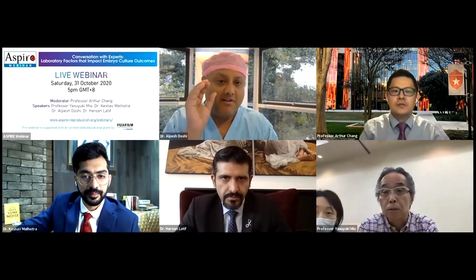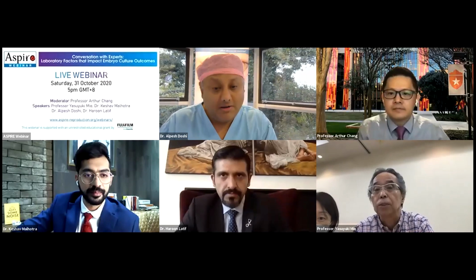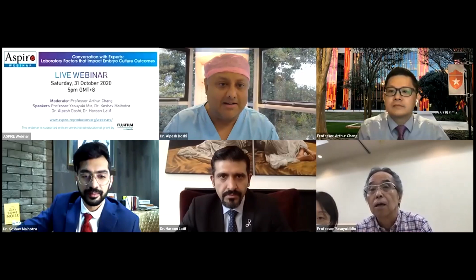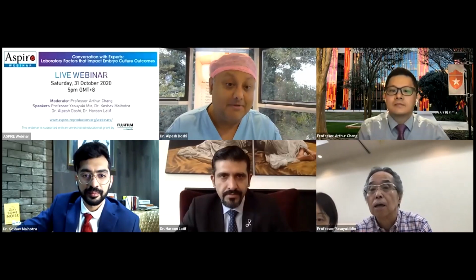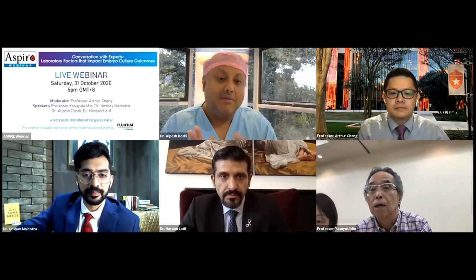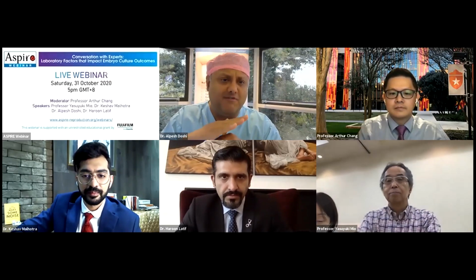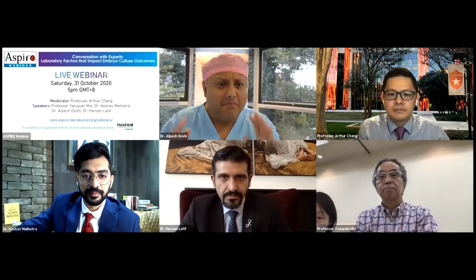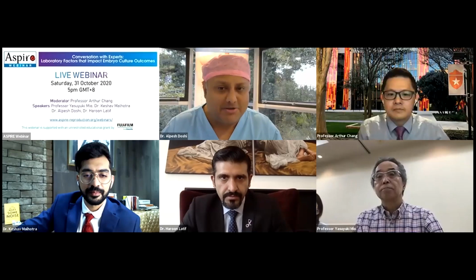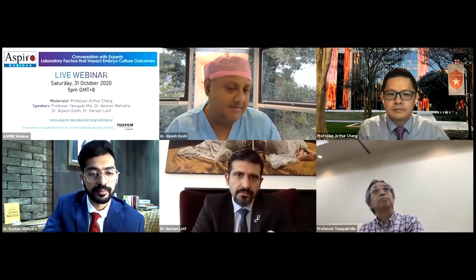You use those few cells that are in your biopsy pipette to flick against your holding pipette. I've got beautiful videos on it, which I can show if time permits, but I understand the time is an issue. So yes, that technique works beautifully well. Again, it may sound traumatic and also look traumatic when you are actually flicking those cells off. But again, what is more detrimental? Keeping on hitting laser shots, which is damaging the cells, or a sharp short cut, which is the flick technique.